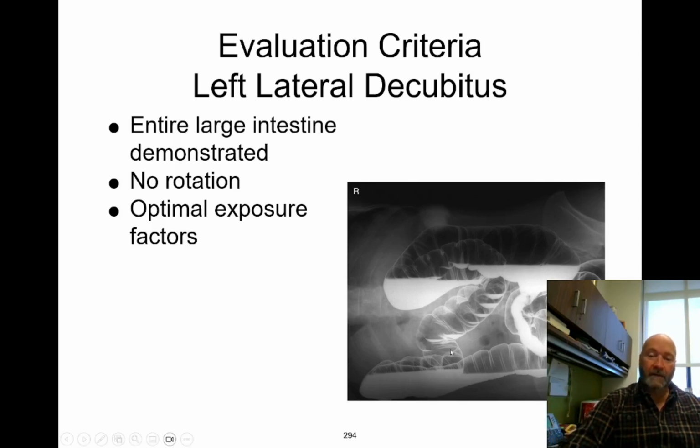Taking a look at this image, we have this anatomy much higher than this anatomy. What that would indicate to me is that this is a left lateral decubitus. The left side is closest to the floor. It's like the patient's laying on the left-hand side. We can also look at this thing right here. That's your right marker. Your decubitus images can be shot AP or PA, either one. I just recommend that you shoot from one side of the table, so naturally one is going to be PA and one is going to be AP.